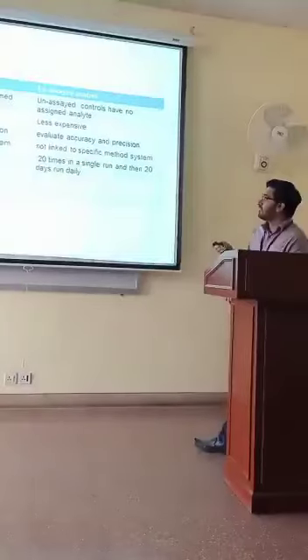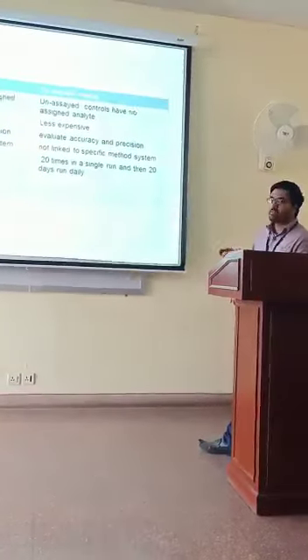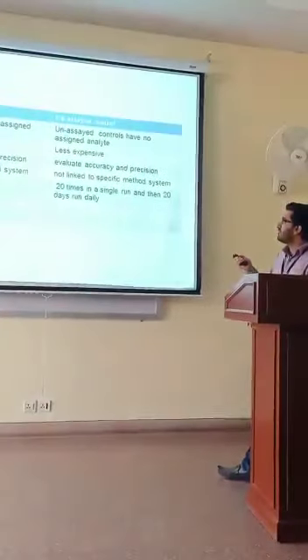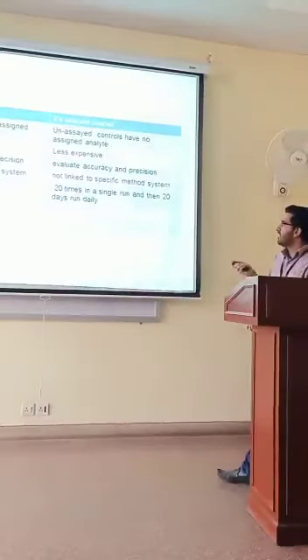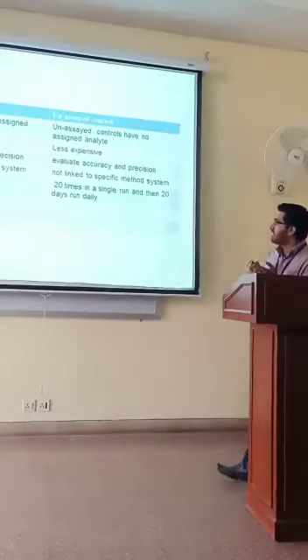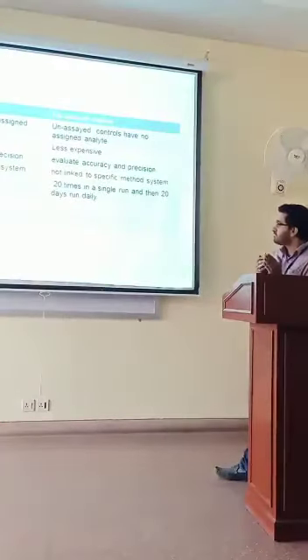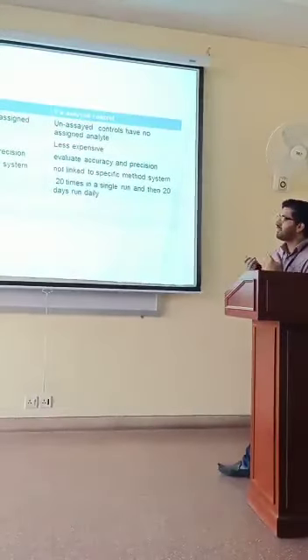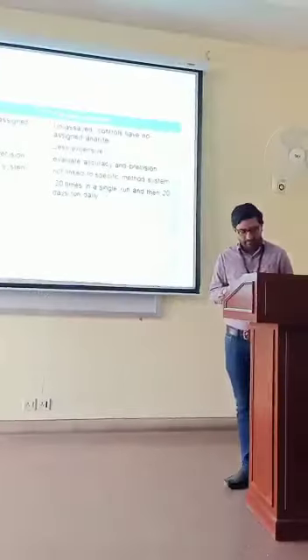And it is less expensive, and it can be used for accuracy and precision. It is not linked to a specific method system, and we can get the values by running the unassayed controls 20 times in a single run, and then 20 days run daily.